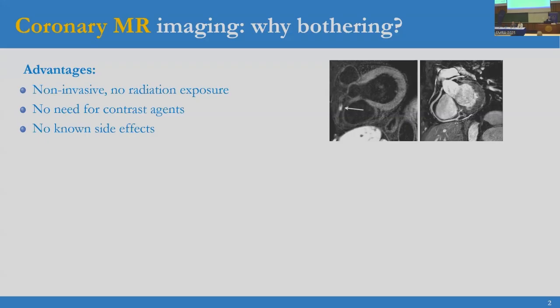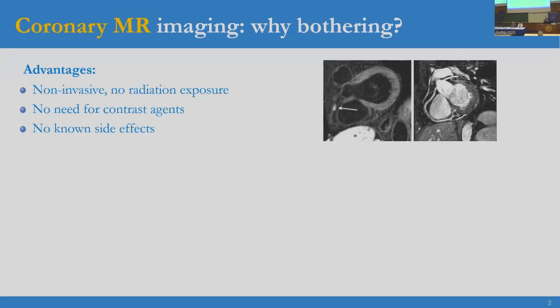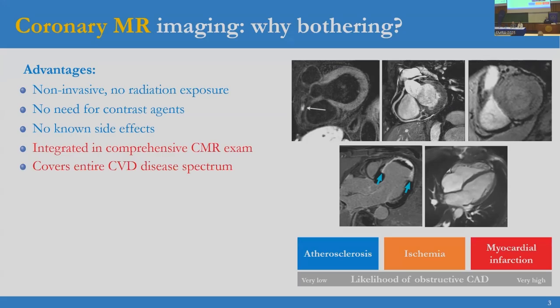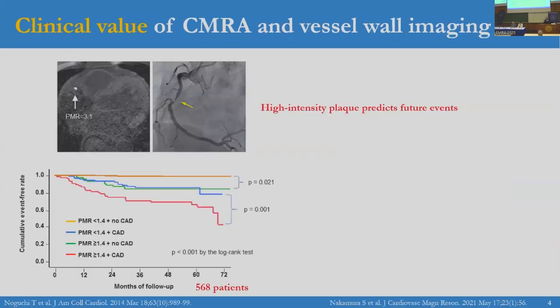One reason is MR is non-invasive. We all know this. We don't need contrast agents. There are no known side effects, and we think the images look nice. And obviously, we can integrate it in a comprehensive cardiac MR exam and thereby cover the entire CVD disease spectrum, going from atherosclerosis to ischemia to myocardial infarction.